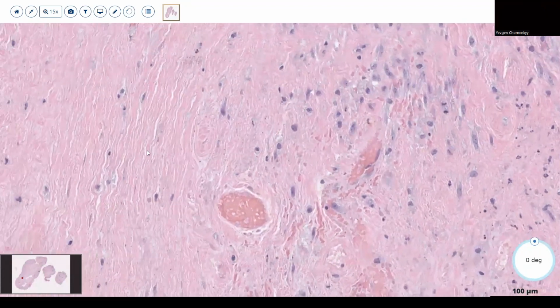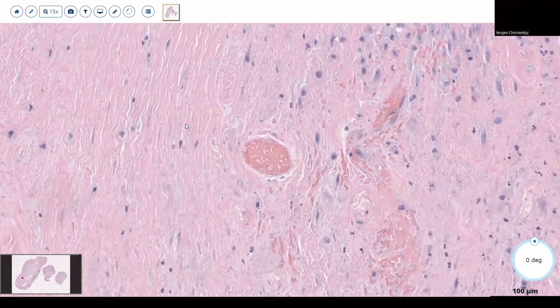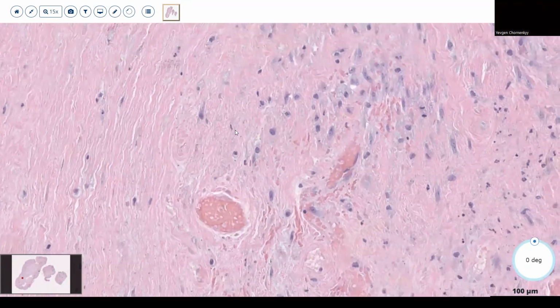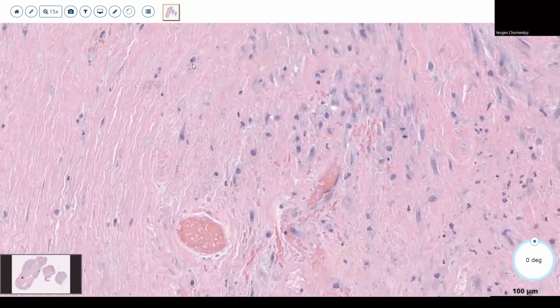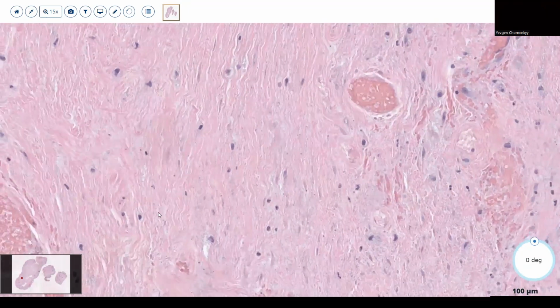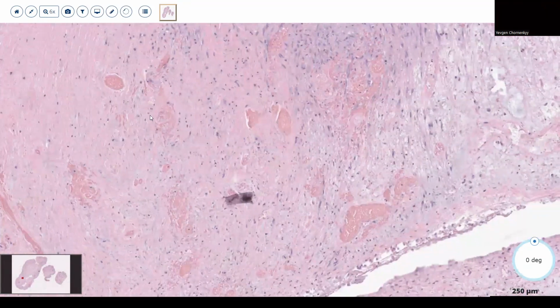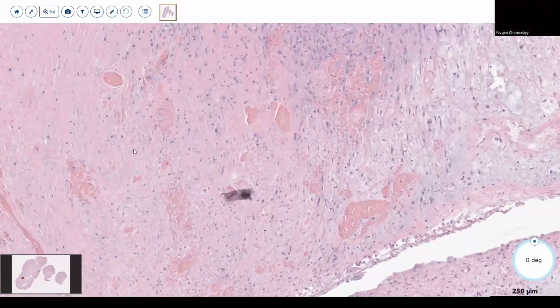Well, there's a mitotic figure that you just walked past. Oh, I did, sorry. It's on the top right. Is it close? That one? Anaphase. It doesn't matter, move on. So there's some of that, okay, that's not great. There's maybe some necrosis, maybe here, hypocellular, right?